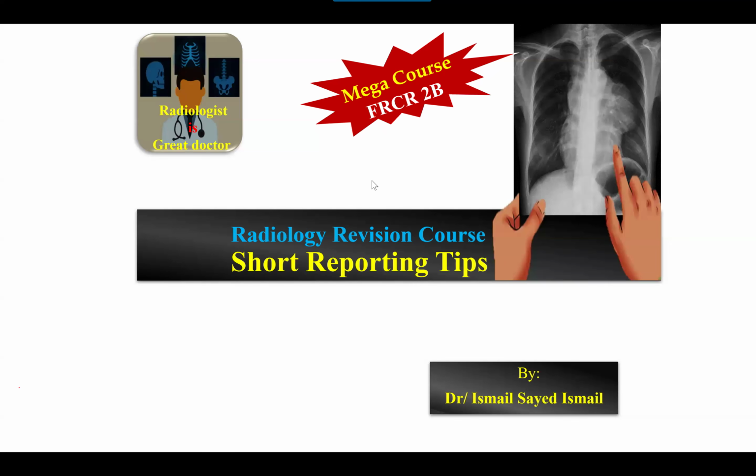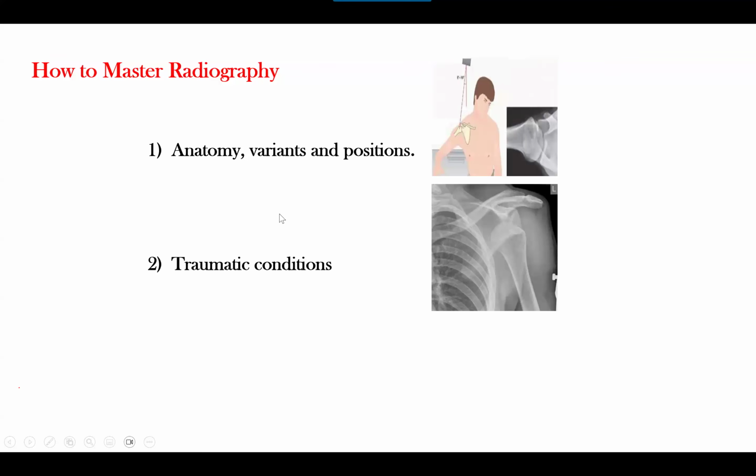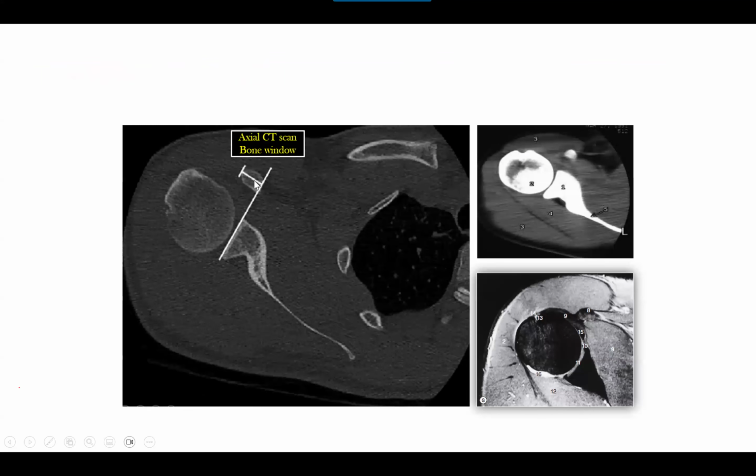Bismillah. How to master reading radiography in your practice? Divide this part into three phases. The first phase: anatomy, variants, positions. Alhamdulillah, in FRCR we covered this part during the first part, followed by traumatic conditions, all traumatic conditions, not just the common, and the non-traumatic conditions, neoplastic and non-neoplastic. I will revise this part in brief.